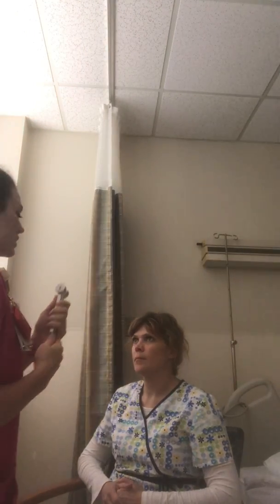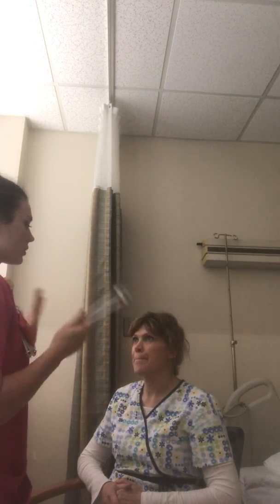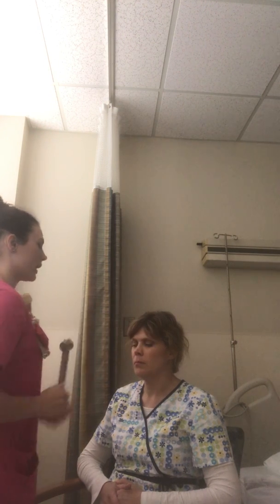Now we are going to do a little test with our tuning fork. This is going to test your cranial nerve 8. First is the Weber test. I'm going to hit it on my hand and put it on your frontal bone. When I do that, I need you to tell me if you hear it more in one ear or the other, or if they're both the same. They're the same. Okay, great.